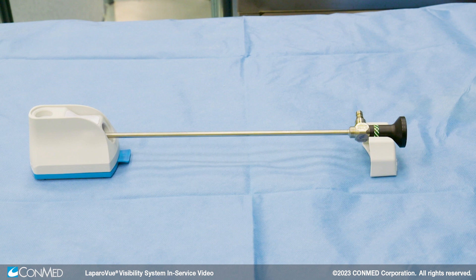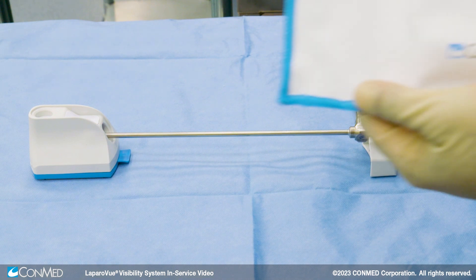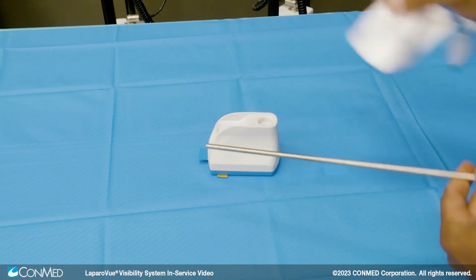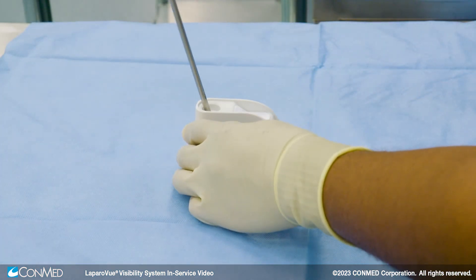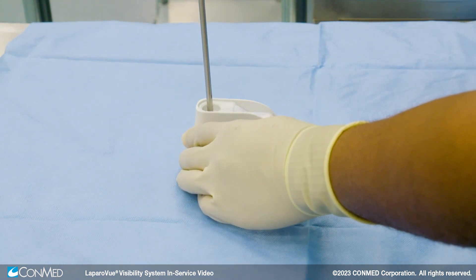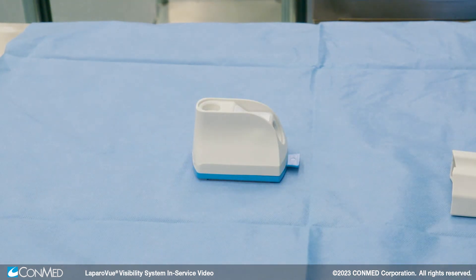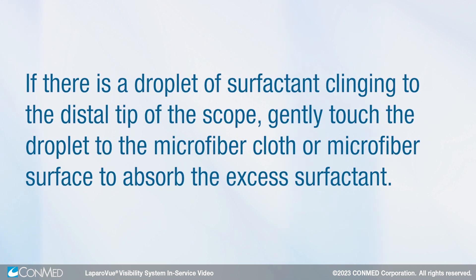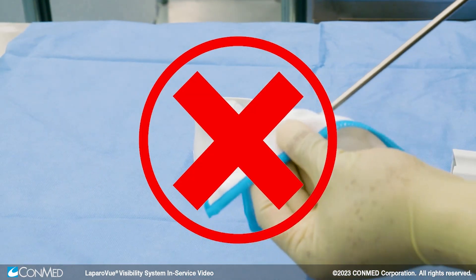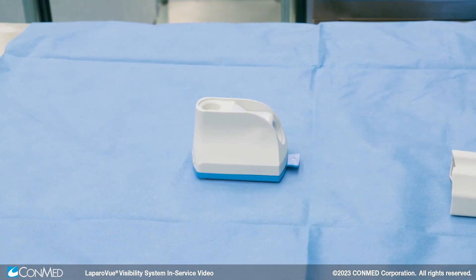If the scope needs to be cleaned during the case, use the vertical port. This cleans and defogs the scope. First, use the microfiber cloth to remove excess debris before insertion into the vertical port. Then insert the scope into the vertical port and gently rotate the scope back and forth. LaproView provides both a chemical and physical clean which results in a clear image for the surgeon. If there is a droplet of surfactant clinging to the distal tip of the scope, gently touch the droplet on the microfiber cloth or microfiber surface to absorb the excess surfactant.